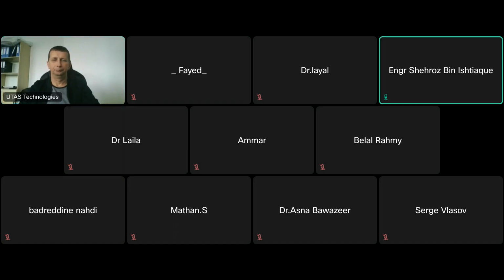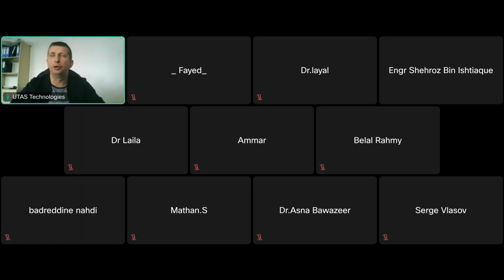What is the minimum weight in grams required, like for infants, the least weight we can attach to the patient? Like for the patient units that we are using for that, how much? Minimum tidal volume is 2 ml, maximum tidal volume 4 liters, minimum body weight of patient to be ventilated 0.3 kilo.